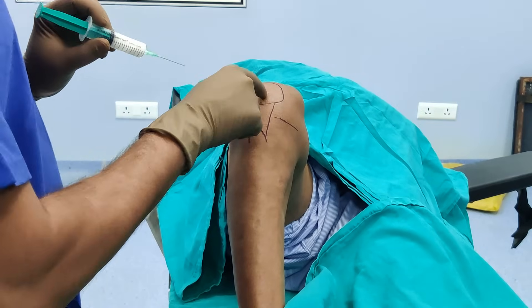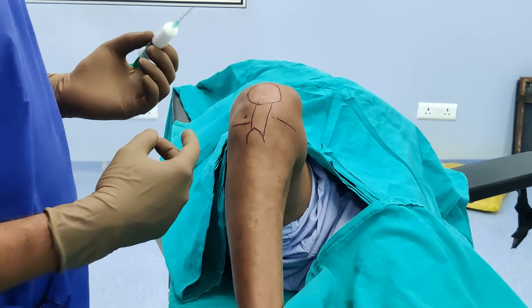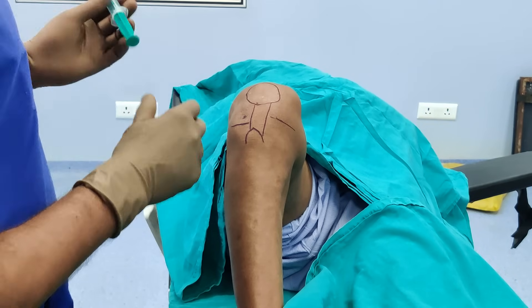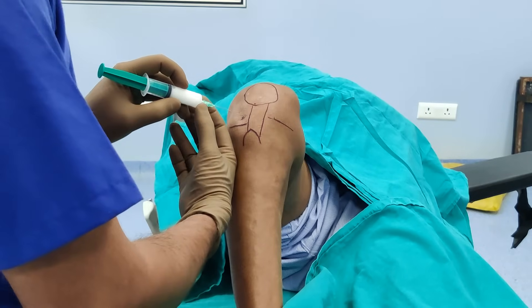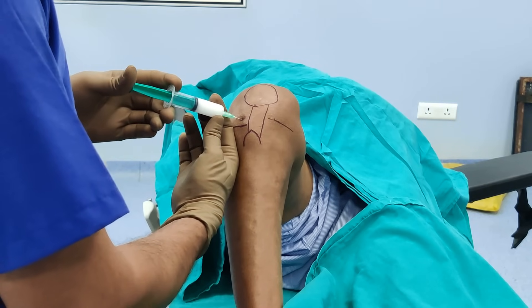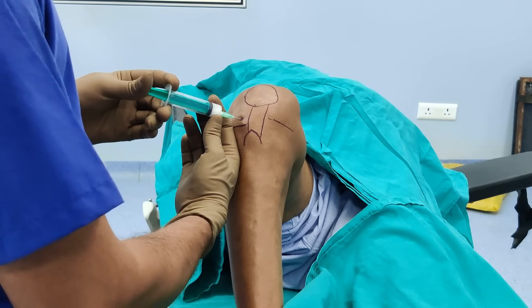You are aiming for the trochlea of the femoral condyle. People can give local anesthetic before the injection, but I find that useless because you need to prick the skin anyway and the patient feels the same amount of pain. So I just shake the needle at the same soft spot, 45 degrees, and just gently in — that's it. Aspirate just to make sure you are not in a blood vessel, then go gently in. The patient is awake and you can see she hardly winces. It's absolutely pain-free.